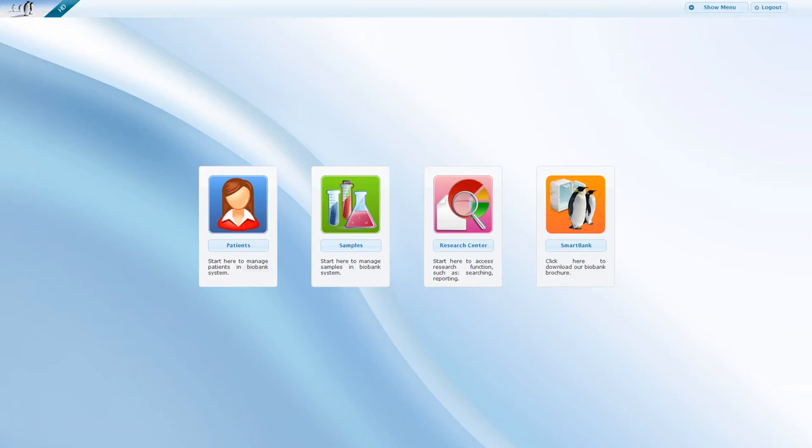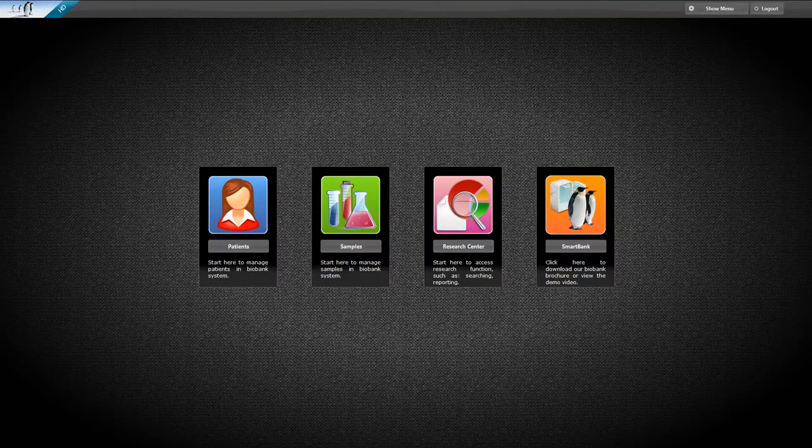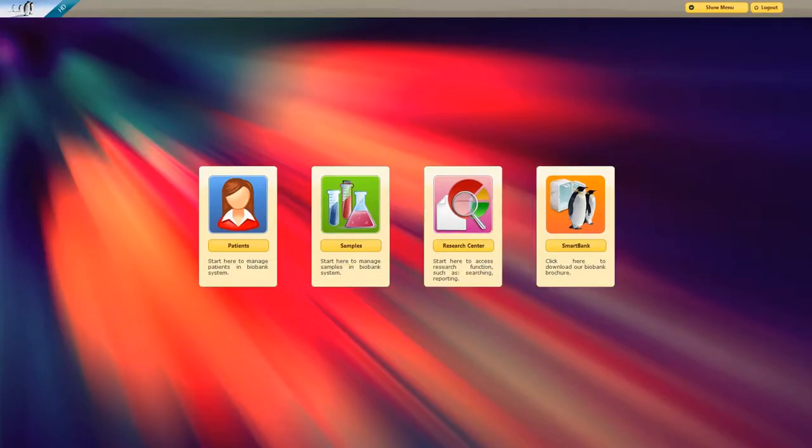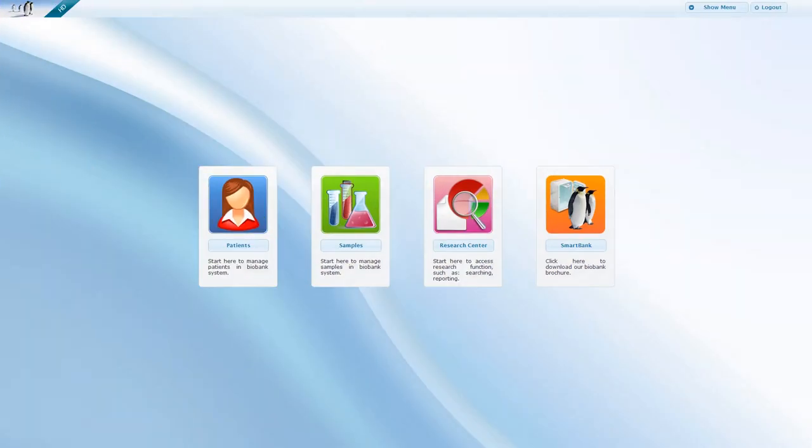Managing patients, samples, or accessing the research center. SmartBank has a customizable user interface. You can change the background or the main theme easily to better suit your taste.